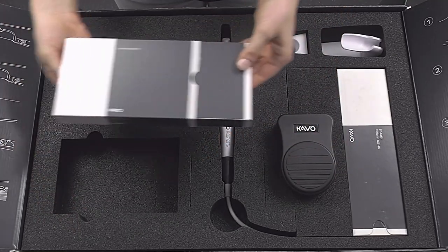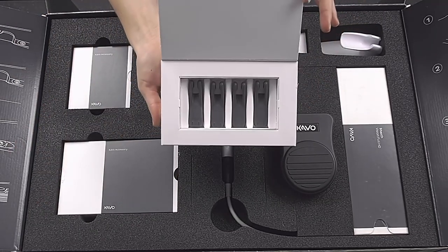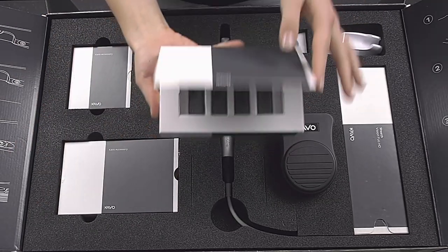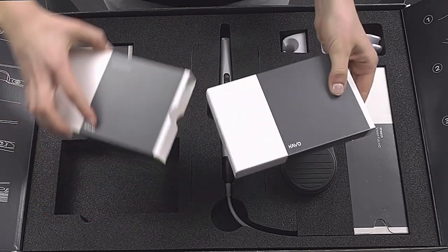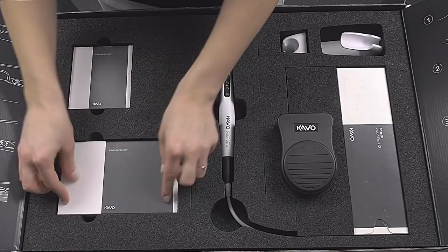If the tip is attached to the camera, it automatically switches to transillumination mode. However, the tip can also be left on the camera for the other recording modes. That saves you valuable time that you would otherwise spend changing attachments between images.